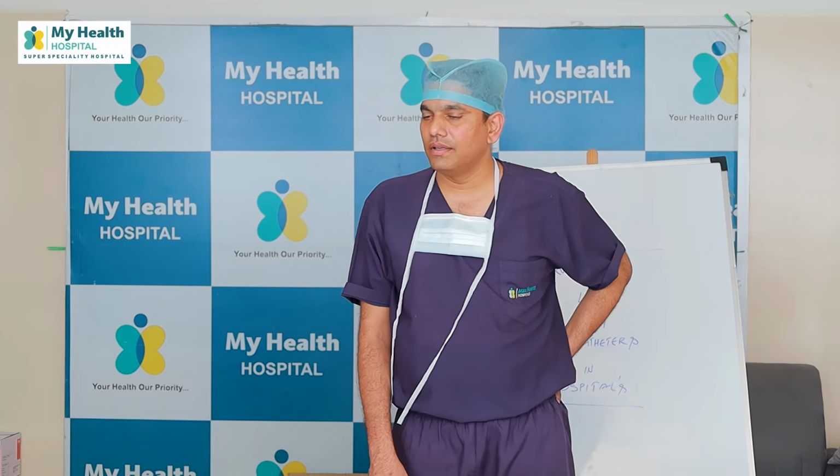Okay, now. What else do we have? Next, what is the ideal time to change a Foley catheter in a chronically ill patient, if he is at home, and if he is in hospital? Days, 14 days, 2 weeks. For a Foley catheter, when the patient is in hospital and when he is at home, 2 weeks. If the patient is sick, in ICU, 10 days or 7 days, depending upon fever, and if there is discharge, we'll change the Foley catheter. If there's any fever, we'll change it. Okay, 21 days, very good.